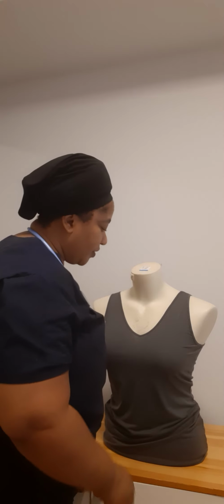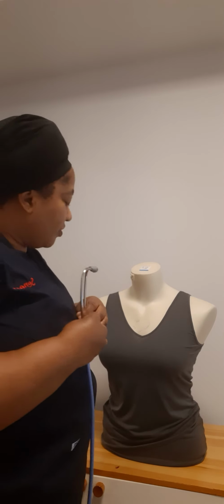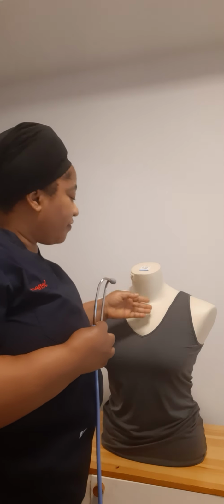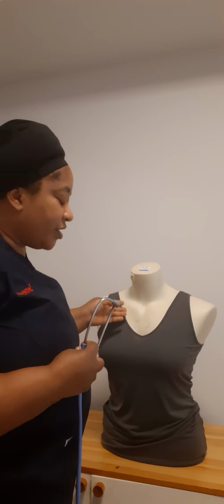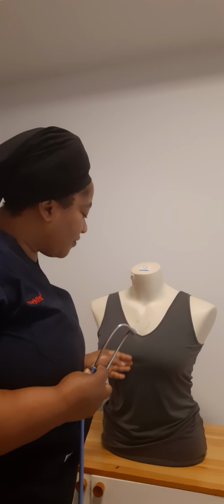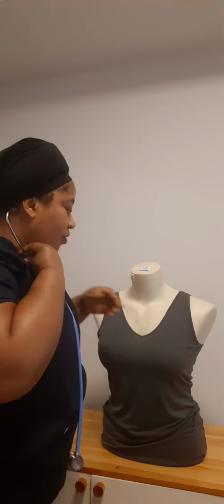Then I'm now going to be auscultating for the heart sound with the valves, and there are 4 valves that I'm going to be checking. The first one is on the second right intercostal space, which is called the aortic. The other one is on the second left, called the pulmonic valve. Then I have the tricuspid valve, which is the 4th lower space. Then the 5th one is the mitral valve, just beneath the breast of the woman. So they are here.